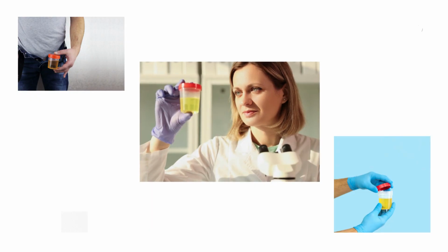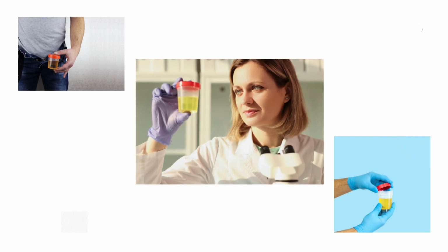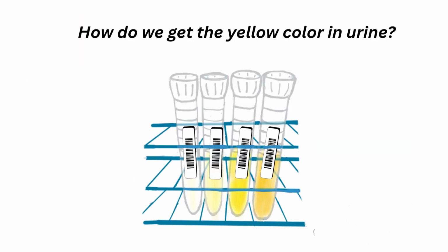Ideally, the patient delivers a midstream, clean catch urine sample collected first thing in the morning. When examining a urine sample, we need good lighting while looking directly down into the clear container with a white background. How do we get the yellow color in urine?